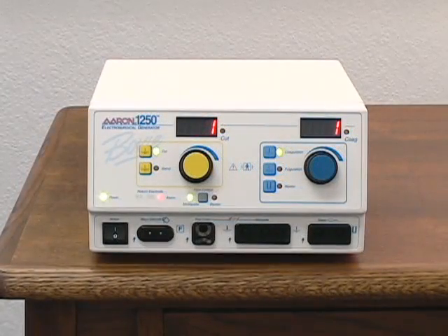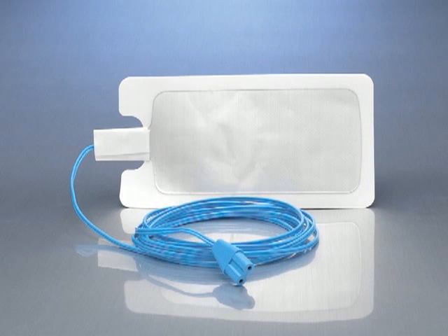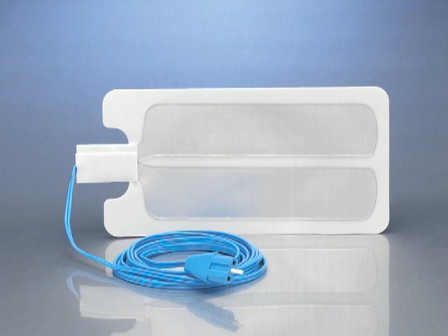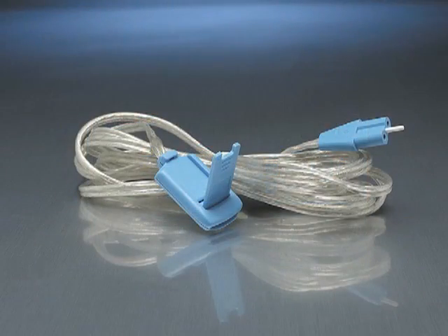The Aaron 1250 is an isolated unit and all monopolar modes require the use of a grounding pad. Grounding pads are available in a variety of configurations: solid pad only, solid pad with attached disposable cable, split pad only, and split pad with attached disposable cable. Pads without cables are to be used with the reusable grounding cable.